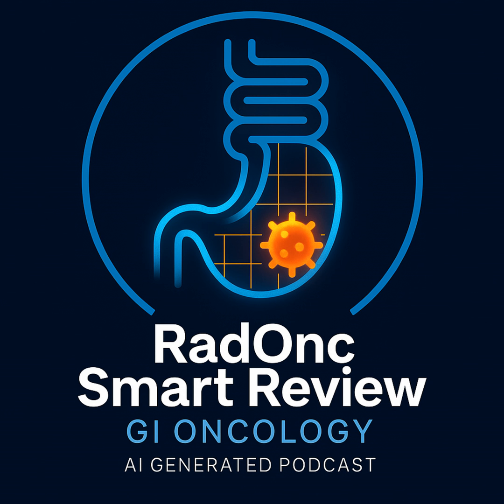Okay. And for image guidance during the actual treatments? Standard practice now is daily kilovolt imaging, KV imaging, like orthogonal x-rays. That verifies the bony alignment is correct each day. Simple, quick setup check. And cone beam CT? We typically do weekly cone beam CT or CBCT. This gives us a 3D picture right before treatment. It's crucial for checking things that KV imaging can't see well, like bladder filling, rectal distension. Exactly. Is the bladder still full like it was at SIM? Is the rectum still relatively empty? If we see significant changes week to week on the CBCT, we might need to adapt the plan.